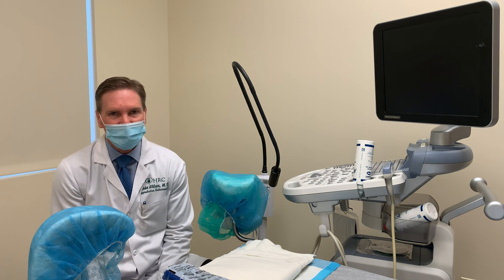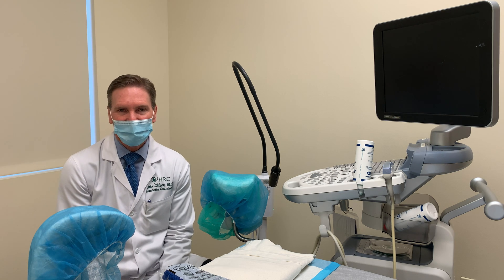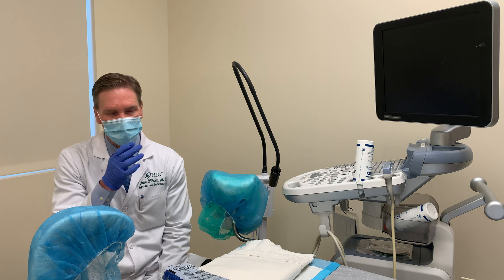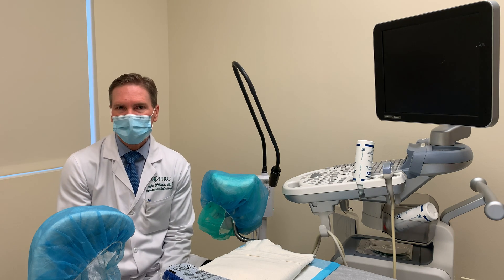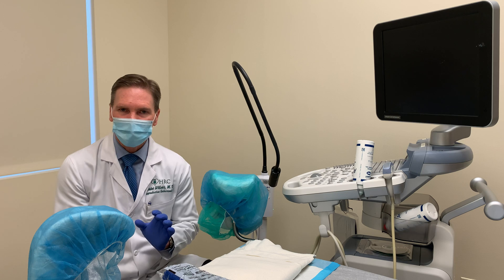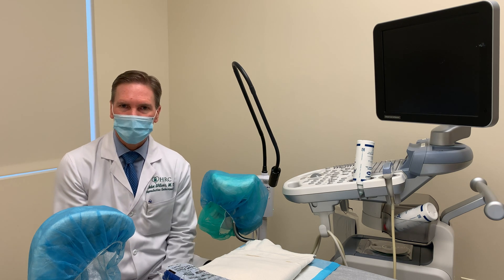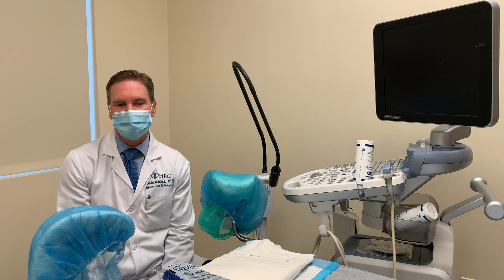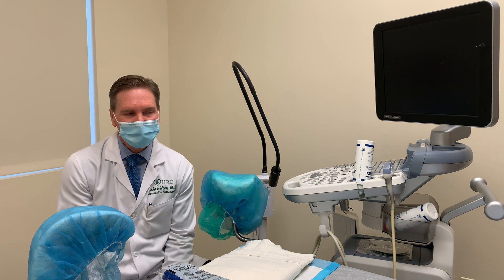The technique for embryo transfer has progressed dramatically over the last 20 years. When we first started we would do the transfer blind, which means we simply place the catheter in the cervix and hope that we would get pretty close to the optimal location, which is in the upper third of the uterine cavity.